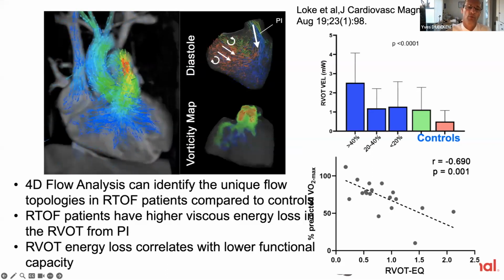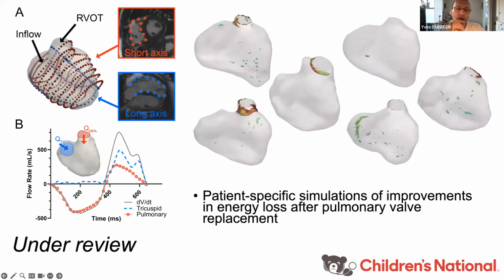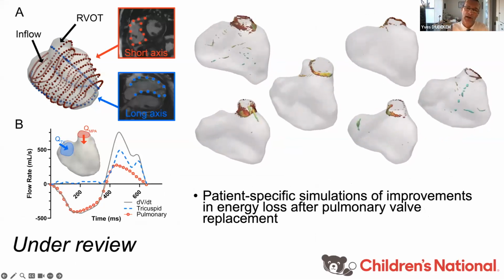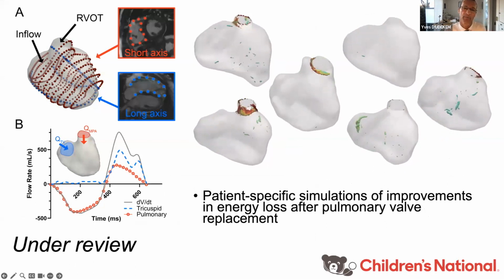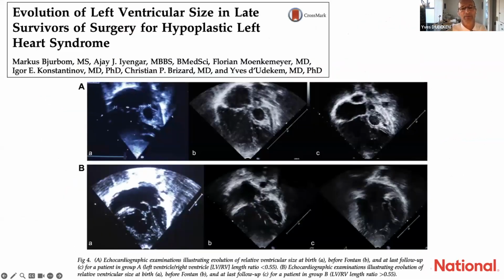And when we say flow topology, it is trying to classify this right ventricle into different types of shapes to see if it's not only a question of volume of the right ventricle, but the way it contracts, which part contracts before the other. What is an ideal shape that still gives you a function, because there are elements beyond just the mere volume.